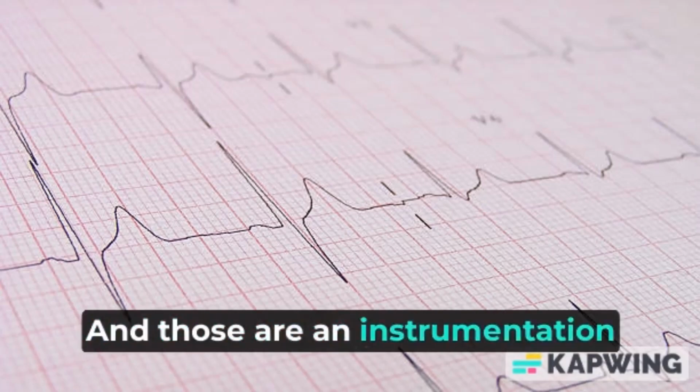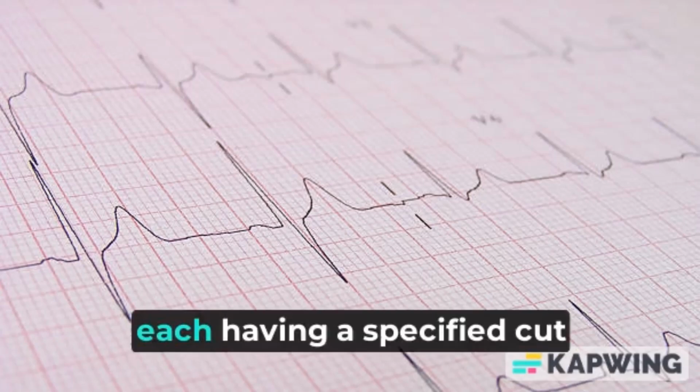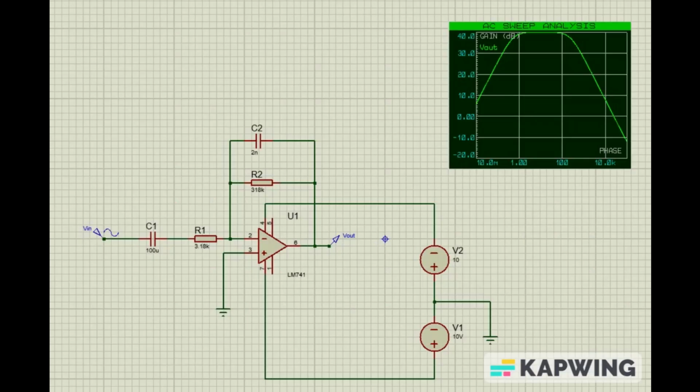And those are an instrumentation amplifier, a band-pass filter, and a notch filter, each having specified cutoff frequencies and gain. So the first step is designing a band-pass filter. As it is known, an ECG signal is a kind of electrical signal that has a certain range of frequencies from 0.5 to 250 Hz. So we can use a band-pass filter to select only signals within this range.